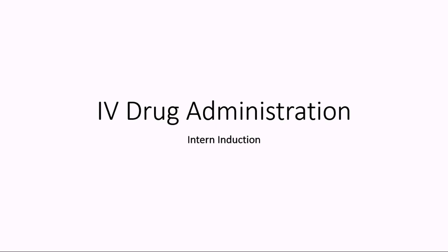A common job that interns are asked to do is to give the first dose of an IV drug. This video describes how to ensure that you administer IV drugs safely. It is easy to make mistakes when giving an IV drug, and this can have serious consequences for patients because the drug enters into the circulation.